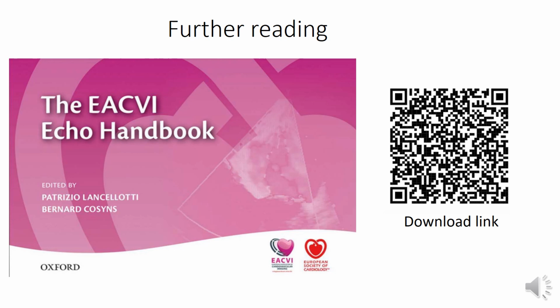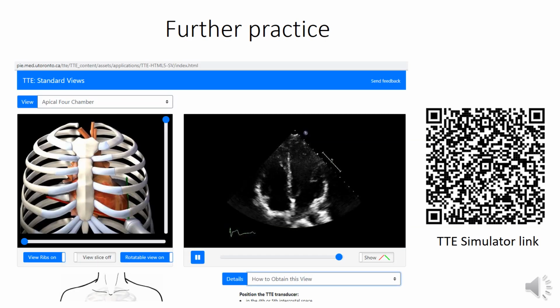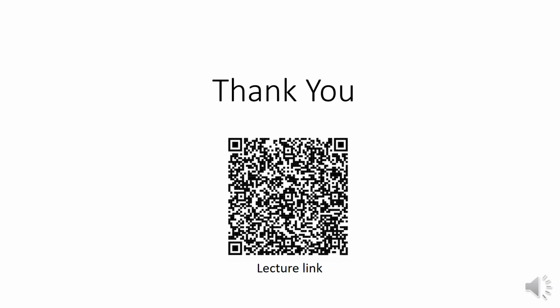Finally, you might find at this link this valuable book of the European Association of Cardiovascular Imaging. It is a good start for echo practice. And this website has a simulator of the different views of echocardiography to get more familiar with different views. And thank you.